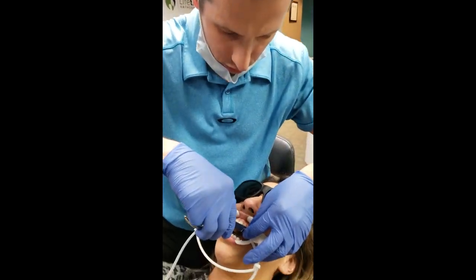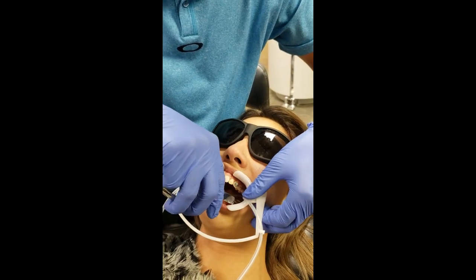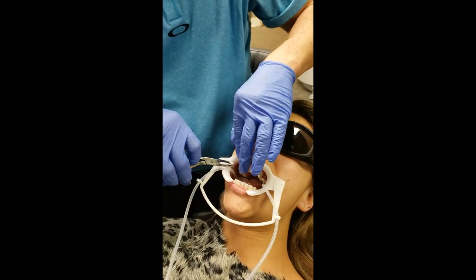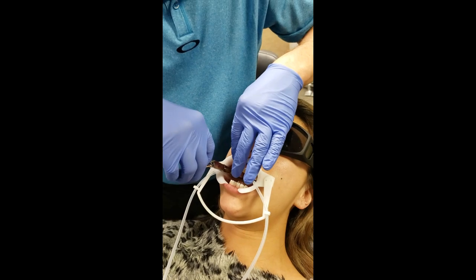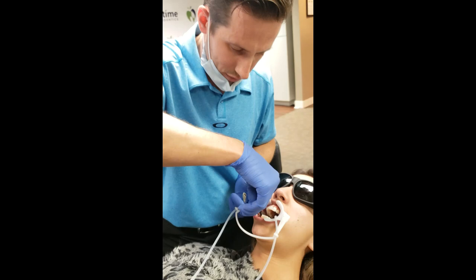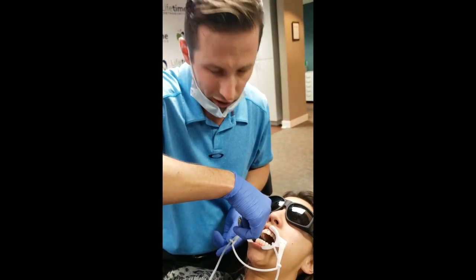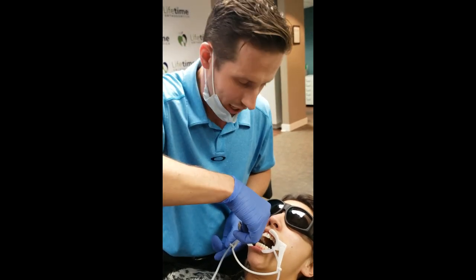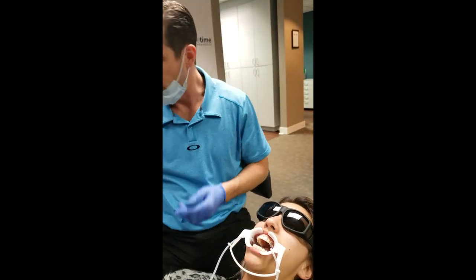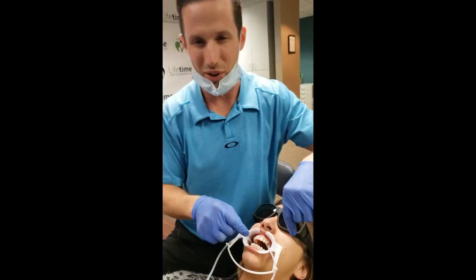I always do the stability test for every bracket or anything we bond. I basically try to rip it off here, because I want it to come off in the chair while I still have everything ready - rather than when they get home. When a patient says 'I was just eating a saltine cracker and it magically fell off,' deep down I know that's not true, because I do this to every single bracket and appliance. This is how I know we put brackets on the right way.